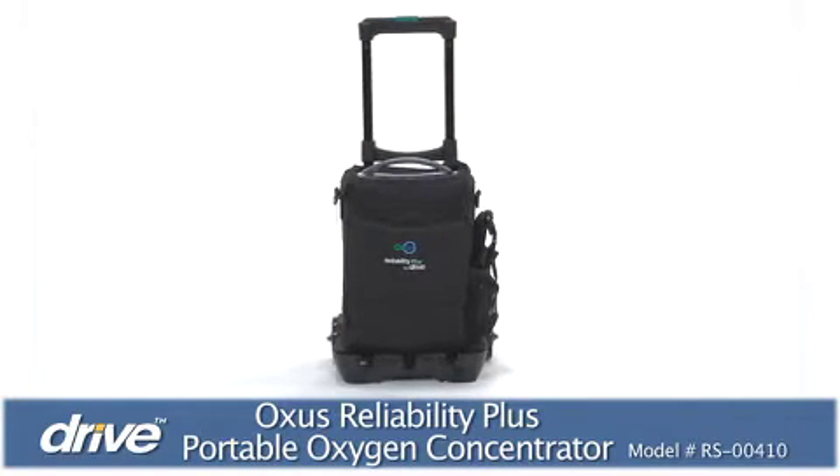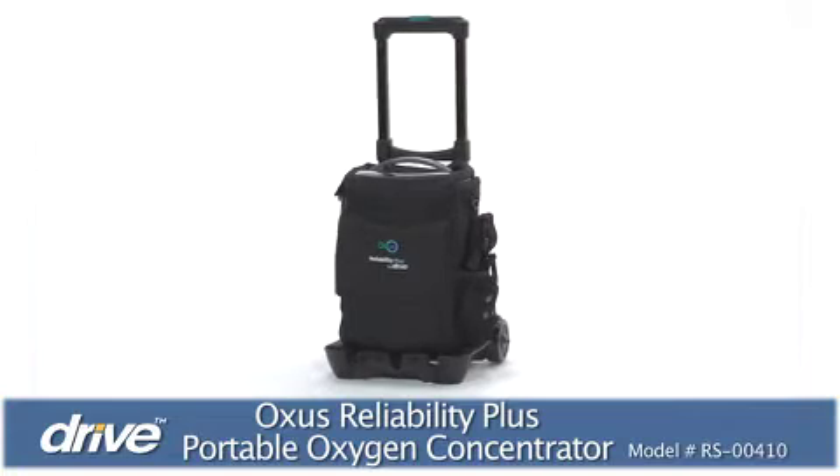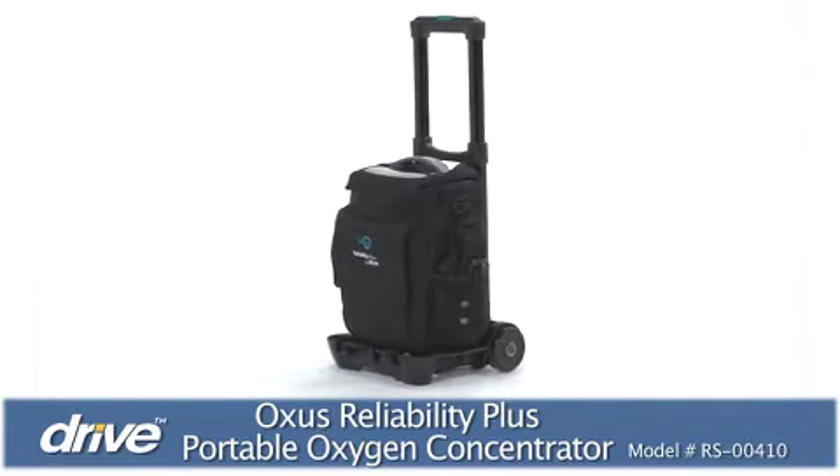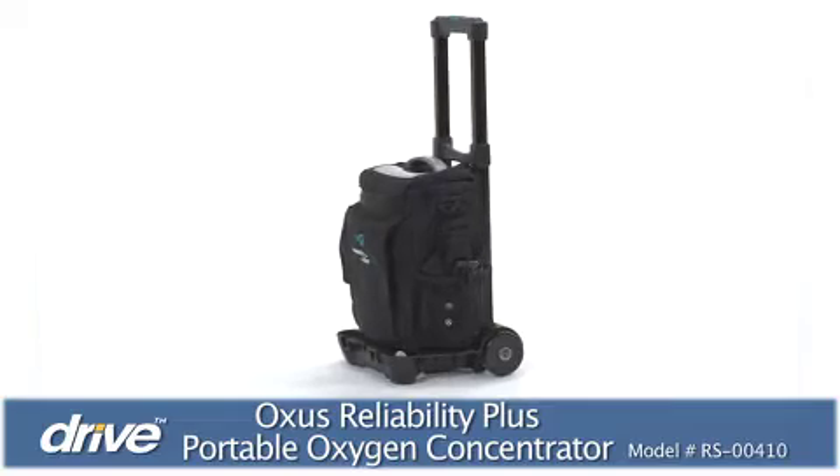Weighing less than 10 pounds with battery, the Oxus is easy to transport, provides an unlimited source of oxygen, imparts ultra-low vibration, and is built to last.